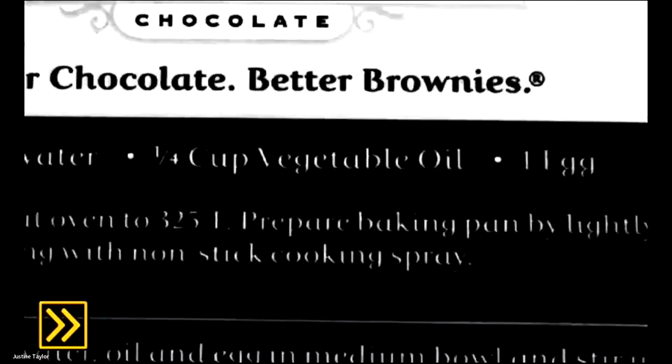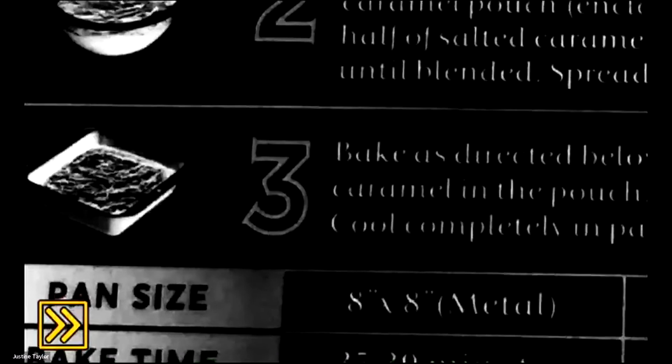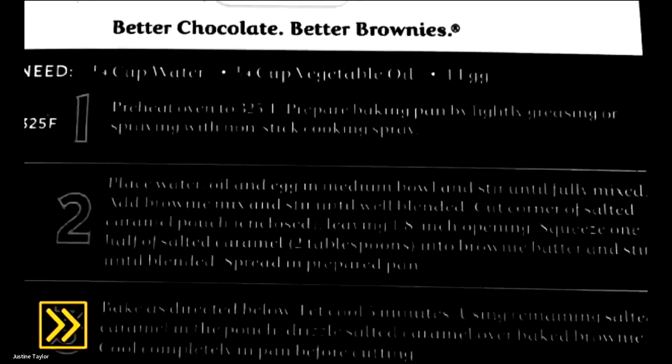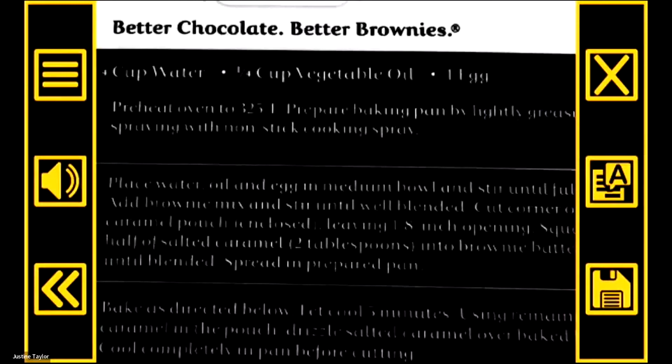So I can just look at this, or I can save it, and I can go through and show you how to save. Restore button. So you hit your restore button and get your button bars up here.